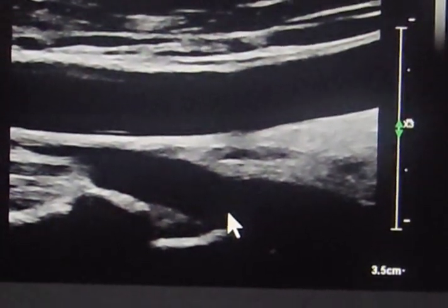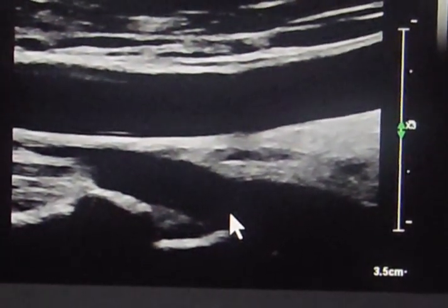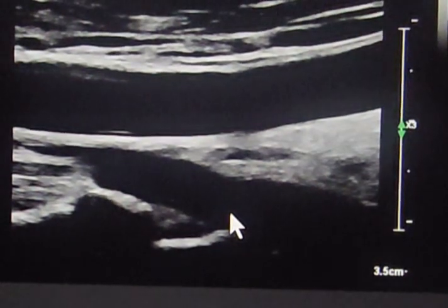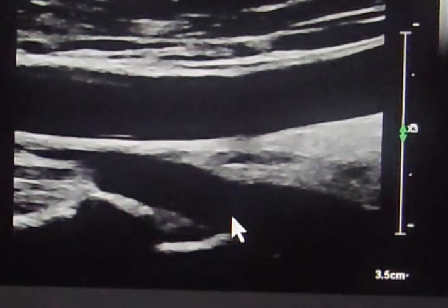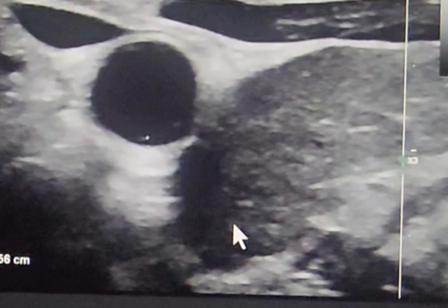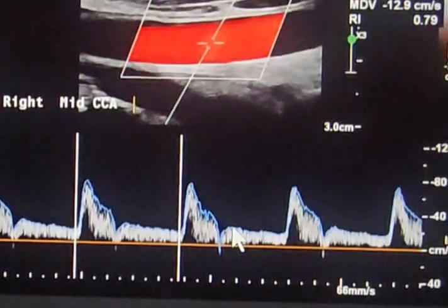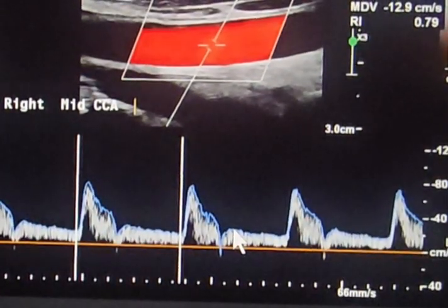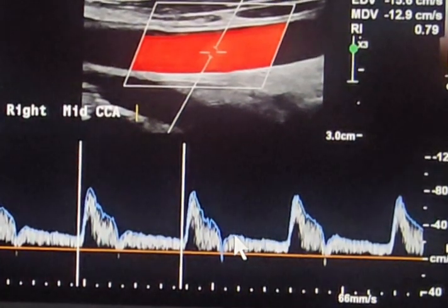We have a patient sent for a carotid duplex study. As usual, we will start our scanning at the mid CCA and distal CCA. We will measure the intima-media thickness, then document some velocities and check the patency of the common carotid artery at mid and distal.